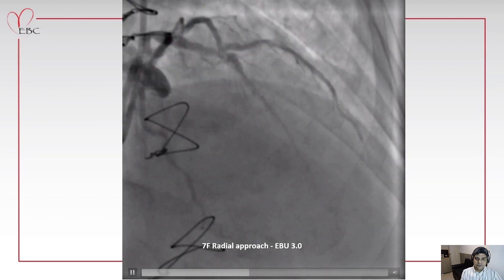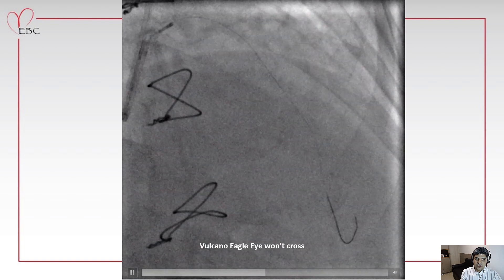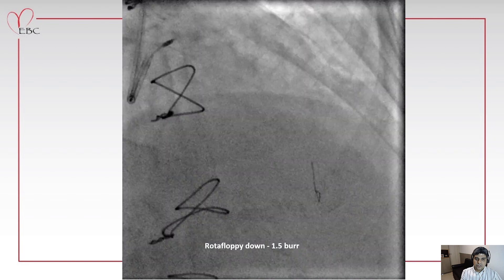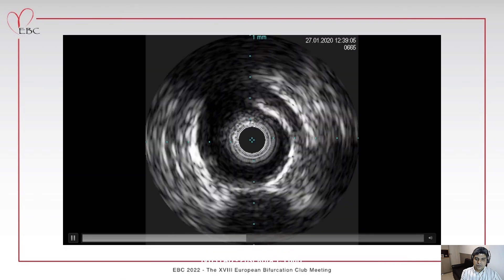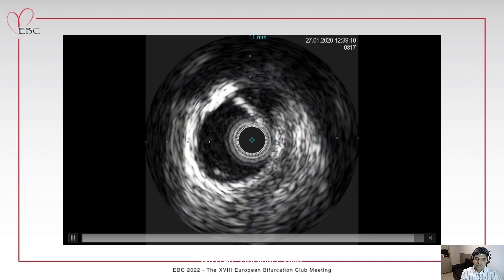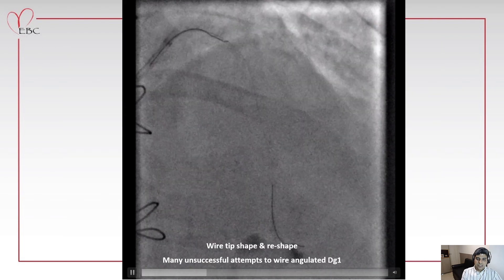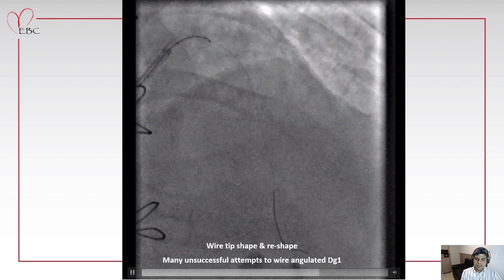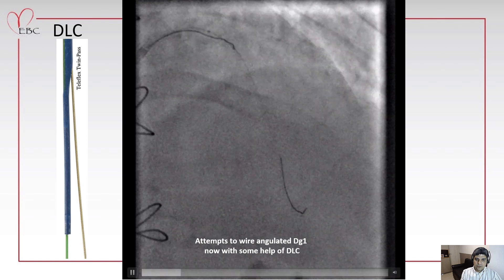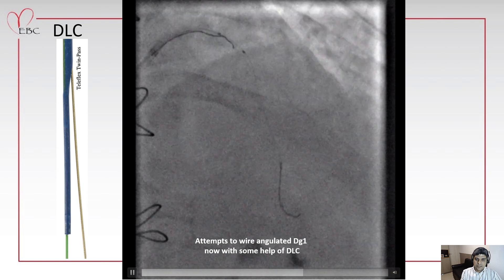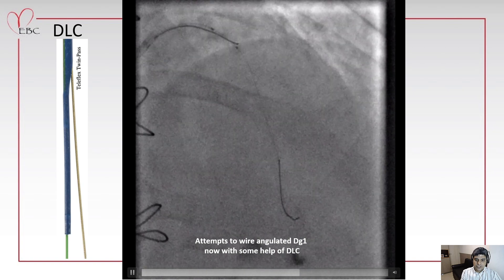This is an example of a calcified LAD diagonal bifurcation. We tried to advance an IVUS catheter but it wouldn't cross. We performed rotablation and started IVUS evaluation, finding a lot of calcium protruding into the lumen, some nodular calcium, and eccentric calcium. We had a hard time wiring the diagonal — we couldn't wire it with many wires in different shapes. We added a double-lumen catheter to the system, but even with it we could not wire the side branch.